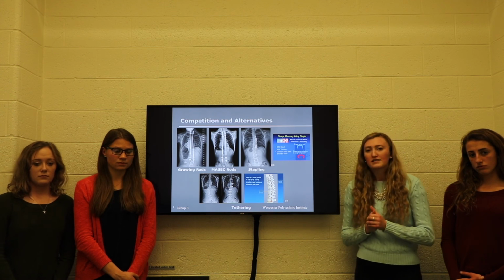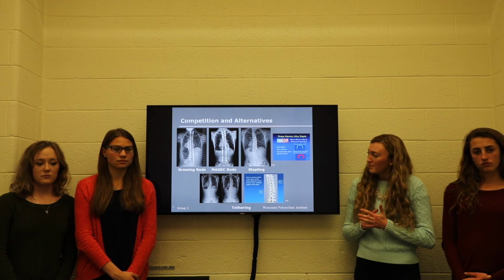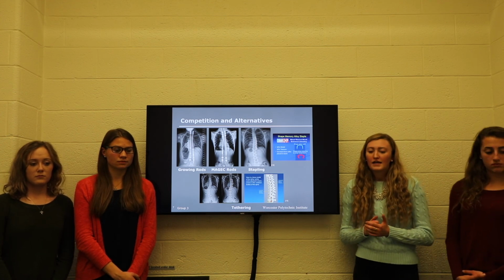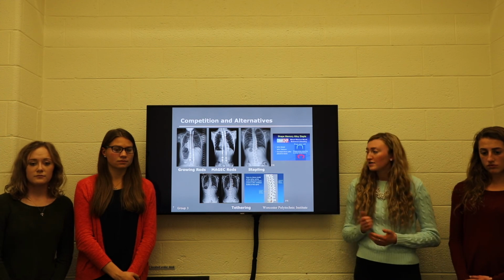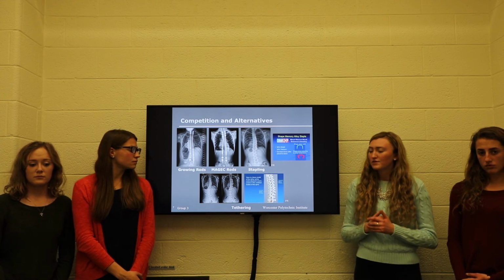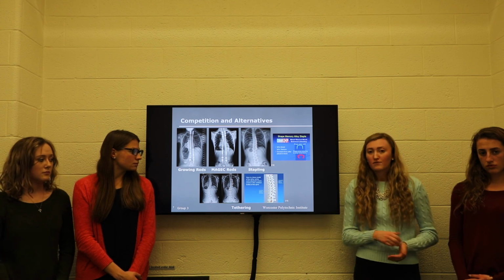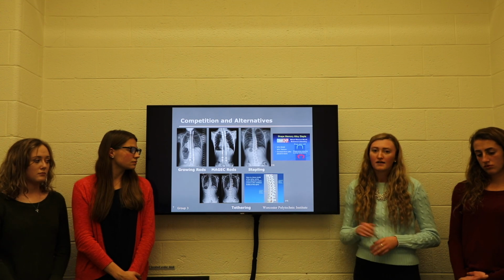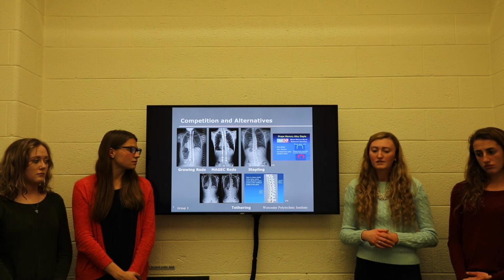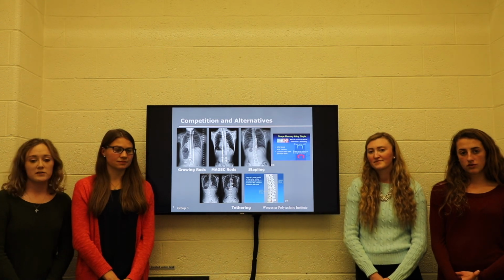And then stapling is another option. It's less invasive and it uses shape memory staples, and it inhibits the growth on one side of the spine while allowing the other side to grow. And tethering is very similar, but it uses titanium screws, which are connected with a cord. It allows for a lot more flexibility and range of motion, but it's only really ideal for patients with less severe cases of scoliosis. Each of these devices has their own advantages as well as limitations.